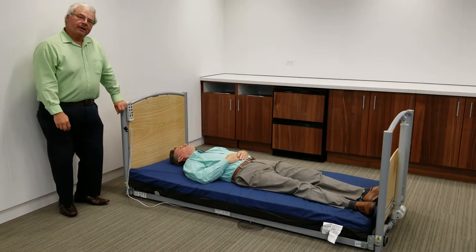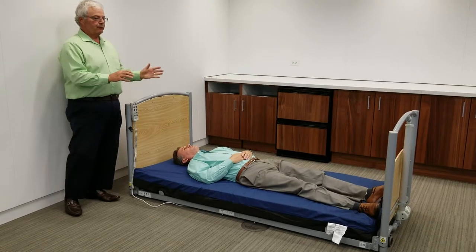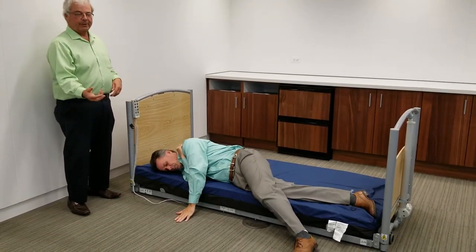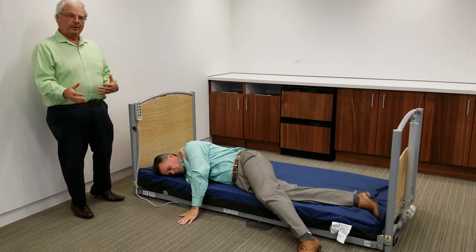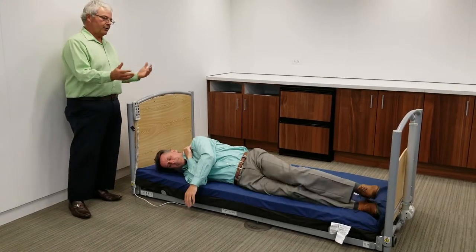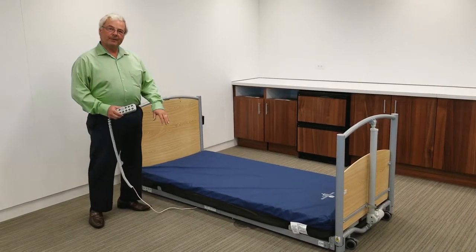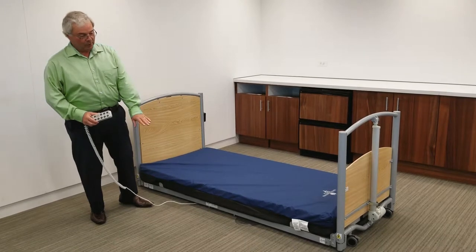What we found in practice from those facilities that have started using the floor bed is that when a patient starts to roll out of bed, the first part of their body that hits the floor is their foot or their hand. What we're finding is that when they feel that floor or our safety mat, they stop rolling and will actually roll back into the bed. Should the patient continue to roll out of bed, the risk of injury is greatly decreased because the mattress is so close to the floor.